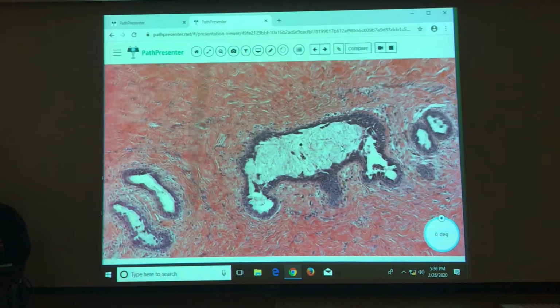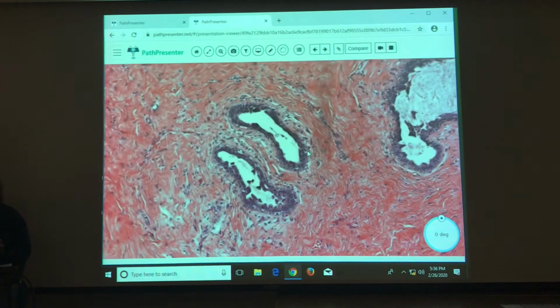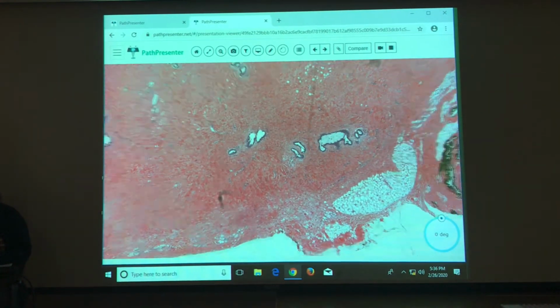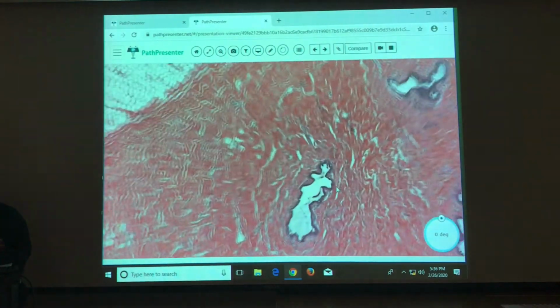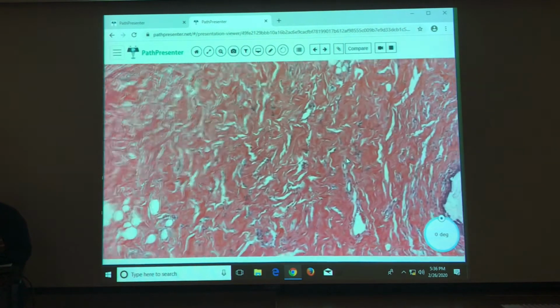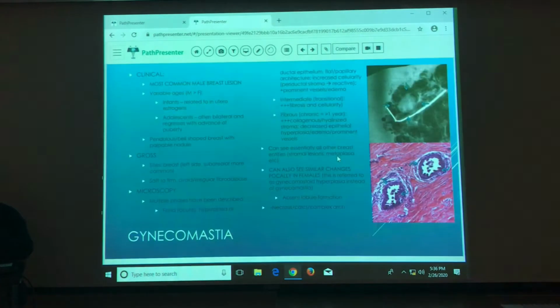I feel for gynecomastia, the epithelial cells will be more proliferative. Like we see a lot of UDH in the glands initially, but as it starts burning itself out, you're going to see less and less of that proliferative look. Okay, makes sense. Often they want them biopsied and taken out right now. So this is what it looks like when it's been sitting around for a while.